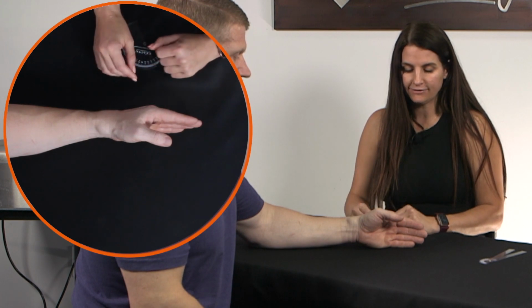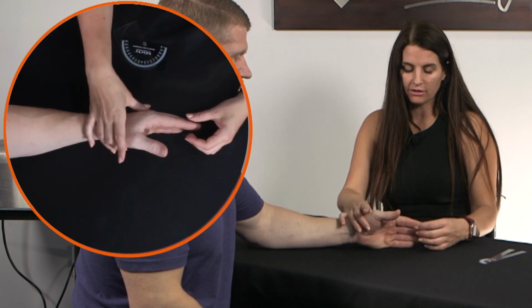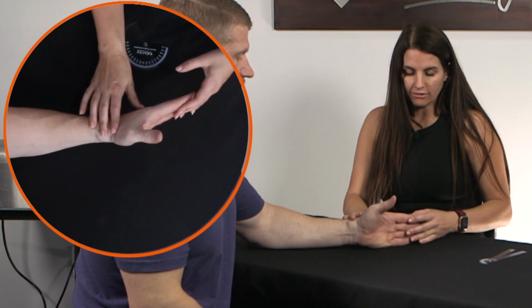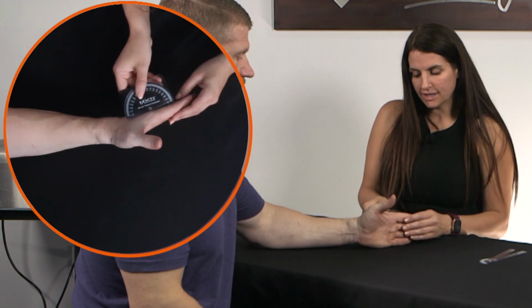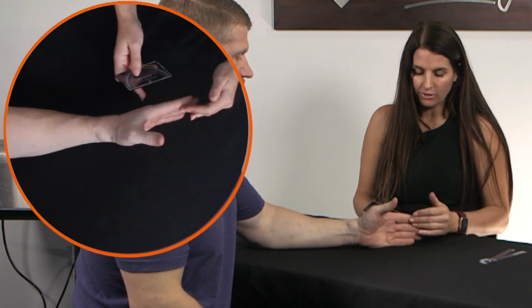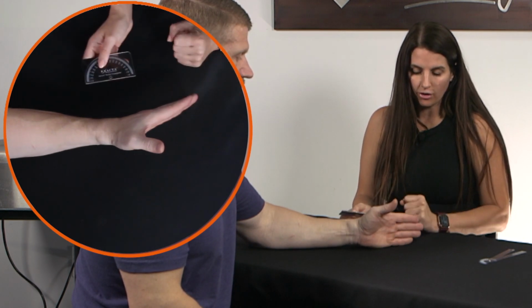Now to cover index finger range of motion, we're going to just use the index finger as a range of motion point, but you would measure all the other digits the same. So first I start by measuring extension, and it looks like he has full extension, so I would notate 0. And then same with the other joints, you can see that they're at 0. Now go ahead and make a fist.